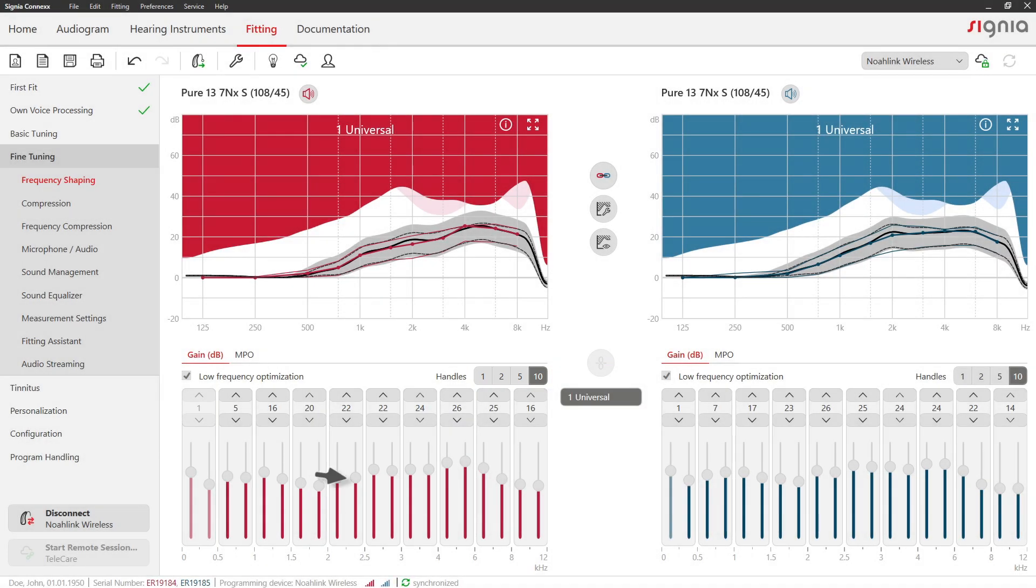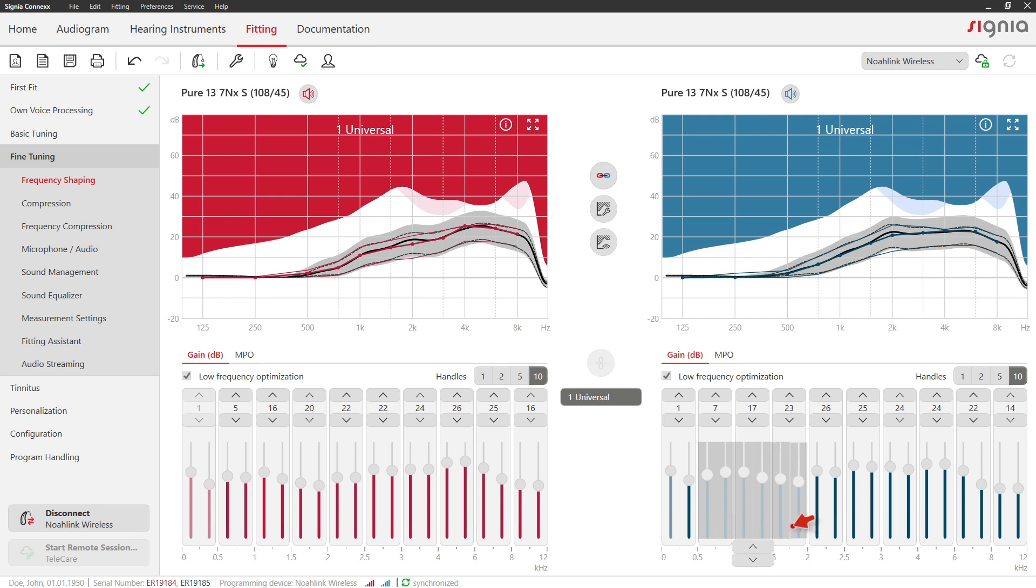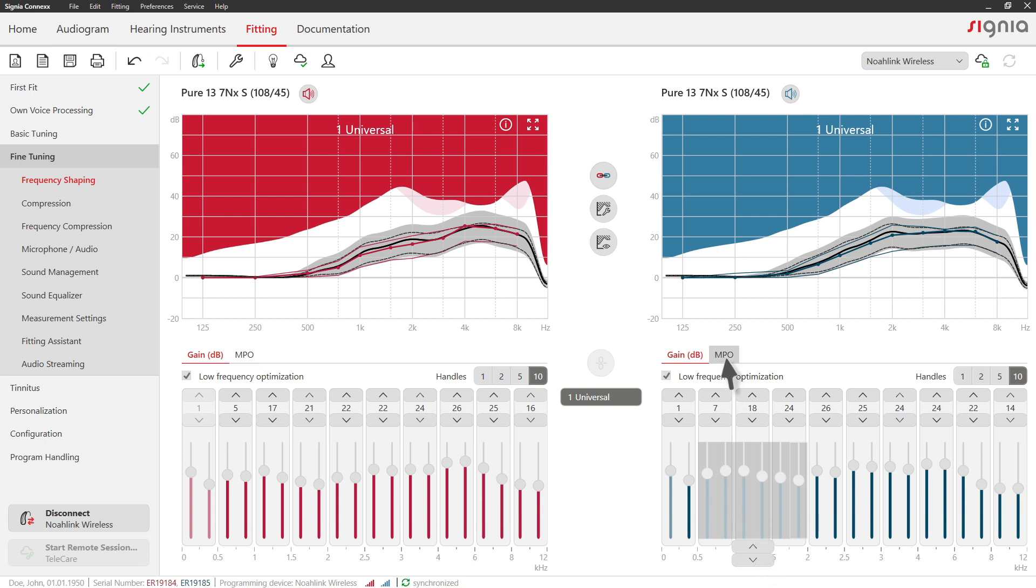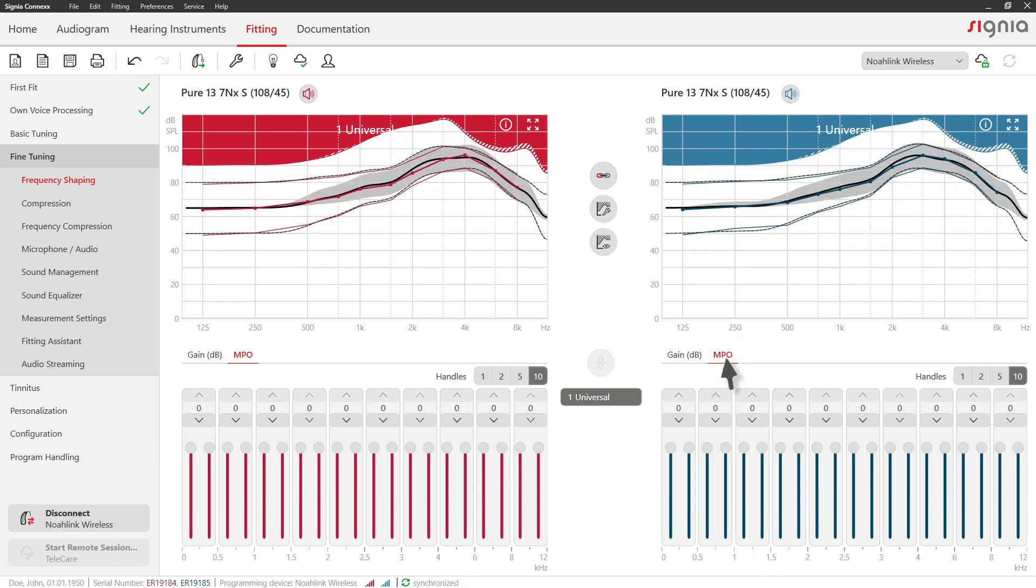You can also mark several channels via clicking and dragging and adjust the gain for all of them at the same time. The same can be done for MPO settings.